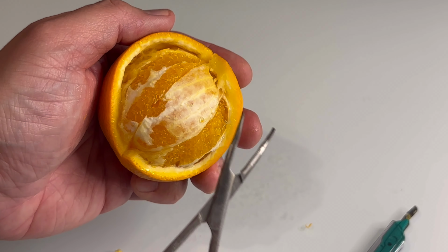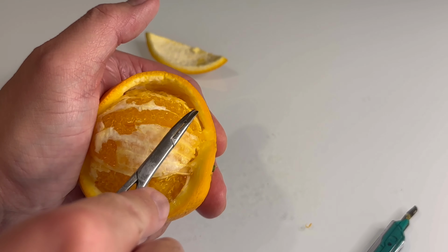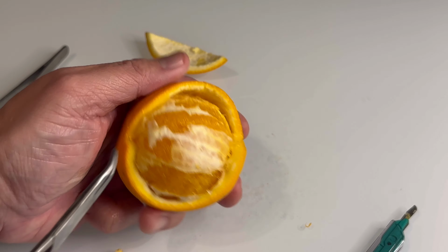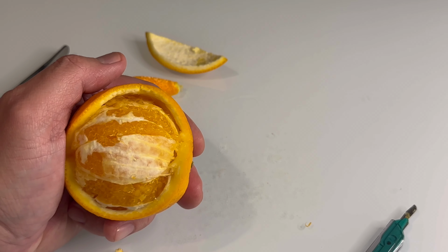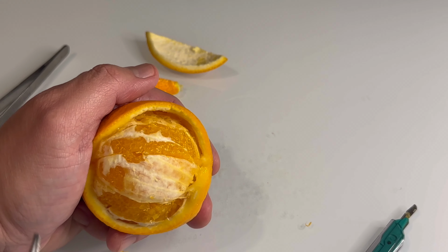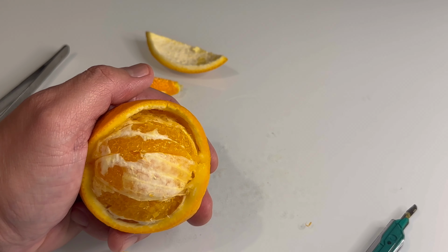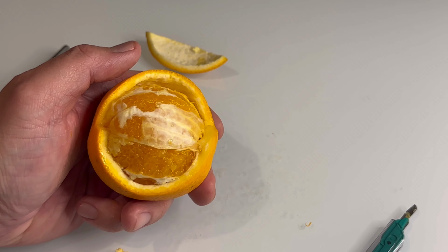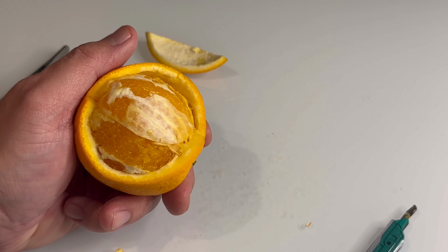And then you spread it, but you have to resect the areas or incise the areas which are attached so that it doesn't actually break. You have to cut it sharply, especially if there is a vessel. It would be better to coagulate it. So those are the methods that you can perform your resection.